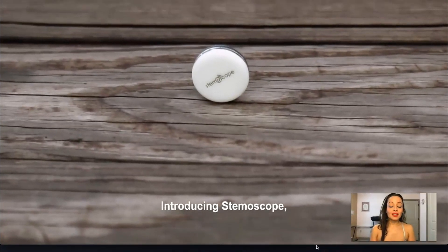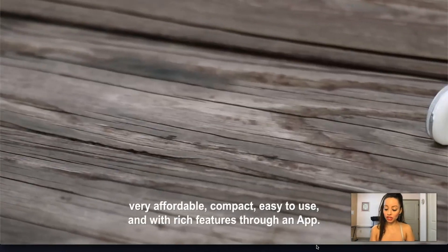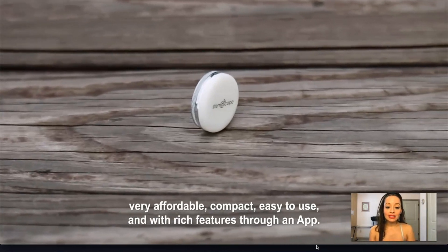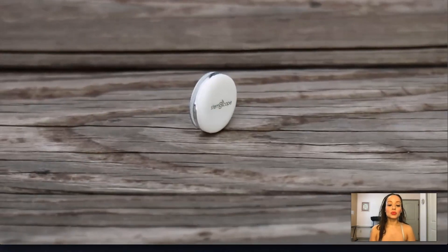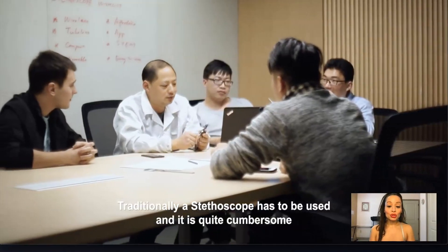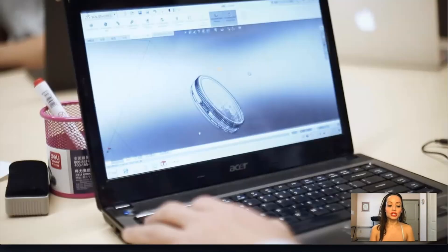This is the Stemascope. It was designed using STEM education, which means science, technology, engineering, and mathematics. It's super compact, easy to use, and a lot less bulky than a traditional stethoscope. I think it definitely has a place in education. It allows you to record sounds that you hear and then play them back, which makes it great for nursing students or nurse educators.